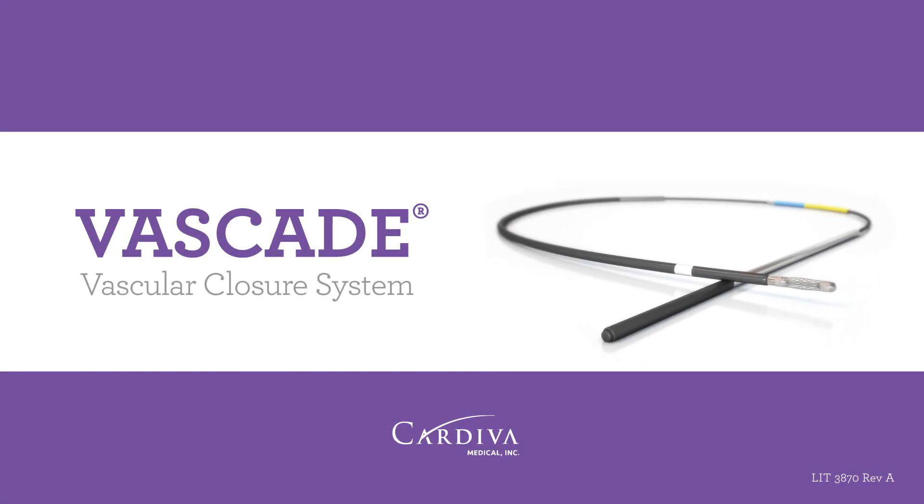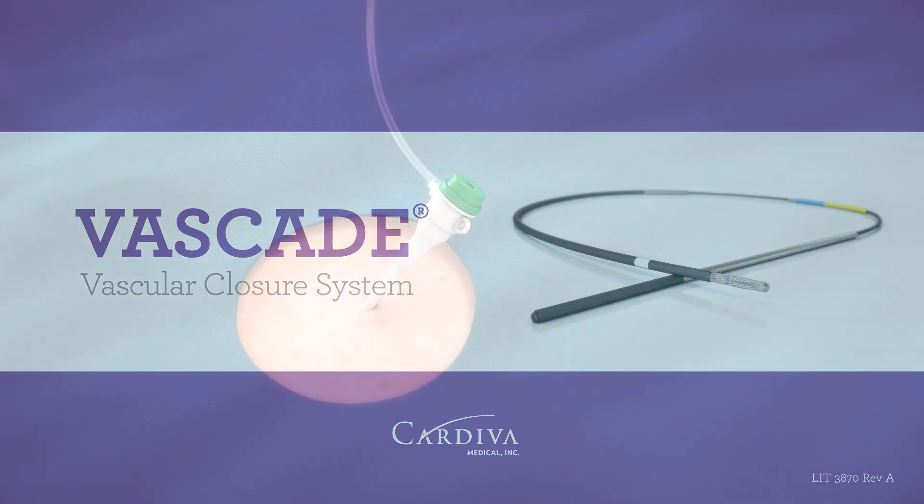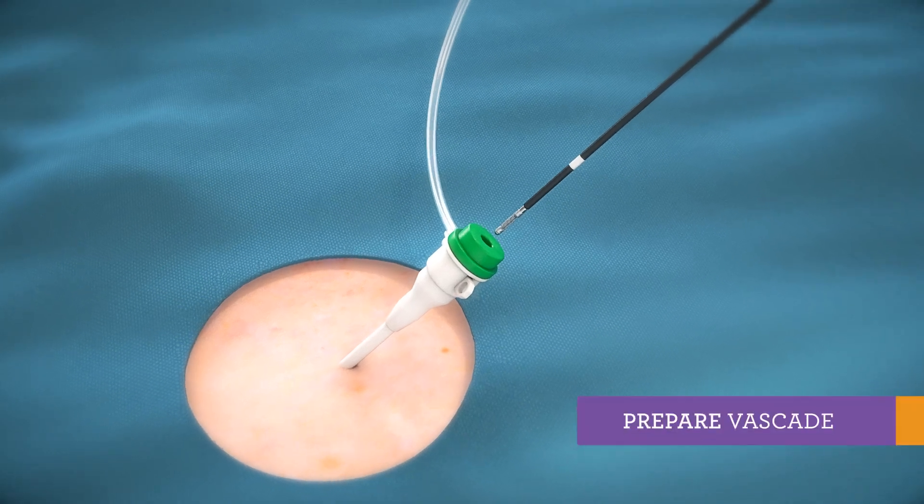Vascade vascular closure system enables rapid hemostasis while minimizing complications. Vascade deploys through an existing 5, 6, or 7 French procedural sheath.